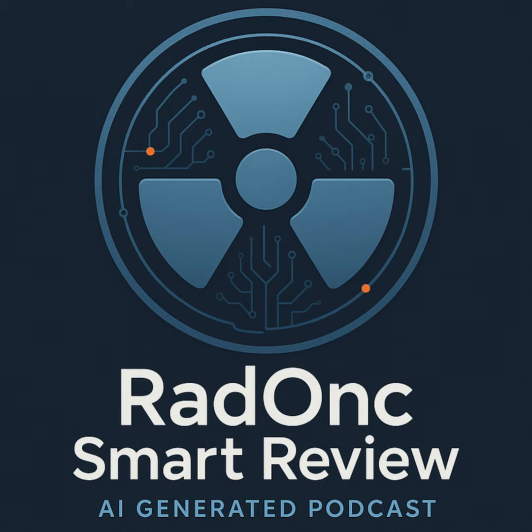Let's try applying this knowledge. How about a quick problem-solving scenario? Sounds good. Let's say you're looking at a CBCT image taken for patient positioning, maybe a pelvis case. The image looks really noisy, grainy. You need better image quality, specifically less noise for accurate alignment. You want to increase the signal without significantly changing the overall contrast appearance of the image. Which parameter would you primarily adjust for the next fractions, CBCT kVp or mAs, and why?